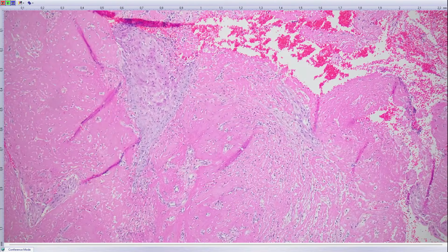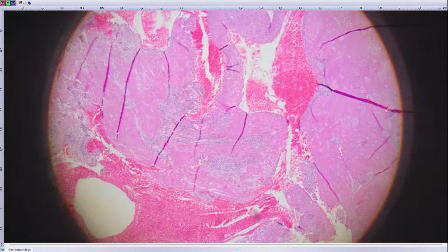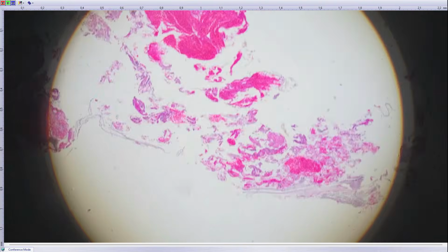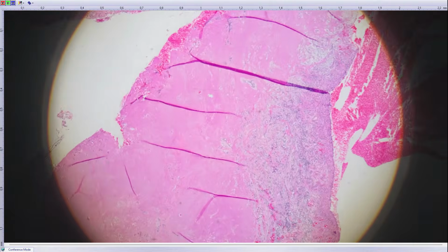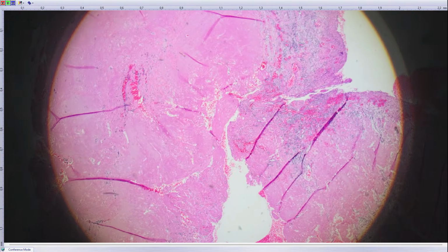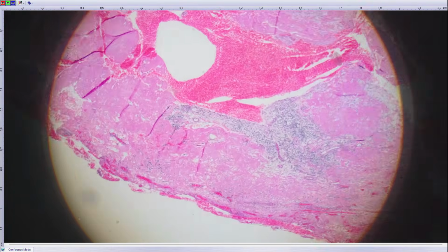Yeah, here I have a very interesting and important diagnosis. It is a lesion of the cervix. And you can find this process very often on the cervix, vulva, vagina, and conjunctiva of the eyes.